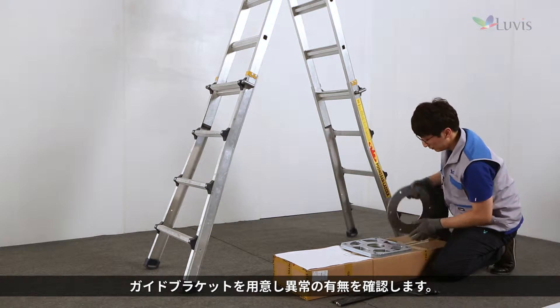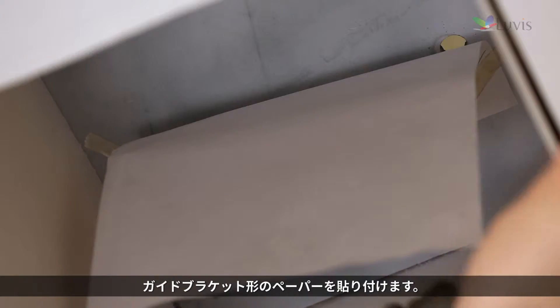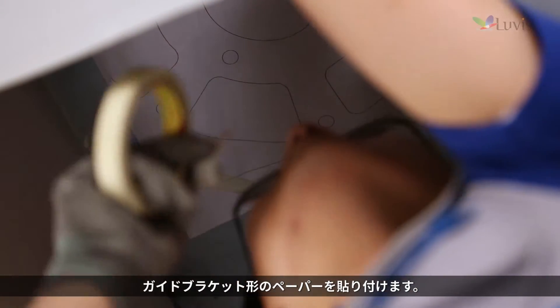Prepare the guide bracket and check its status. Select a spot on the ceiling where the product will be installed, then attach the shape paper sheet of the guide bracket.